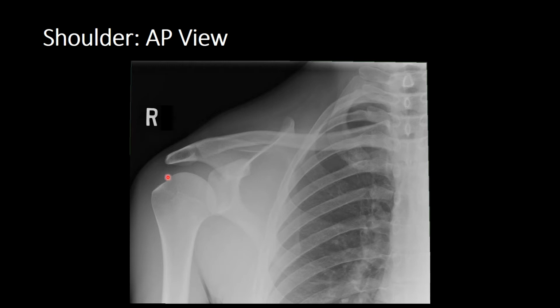The humerus should be held in external rotation so that the greater tuberosity is seen in profile. Always ensure that the arm is relaxed down, because when patients are in pain, they tend to elevate their humerus, which creates the appearance of loss of the subacromial space. The scapula sits obliquely to the chest wall, so that on an AP view, the surface of the glenoid is tilted between 35 to 40 degrees anteriorly.